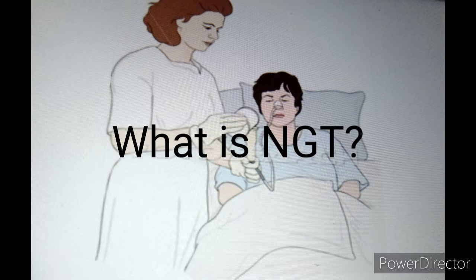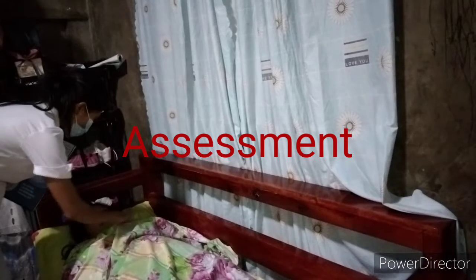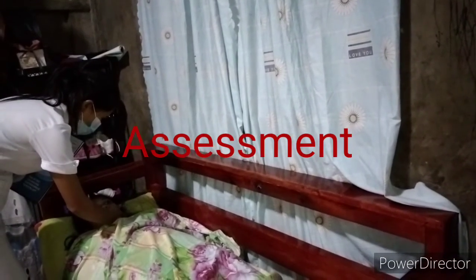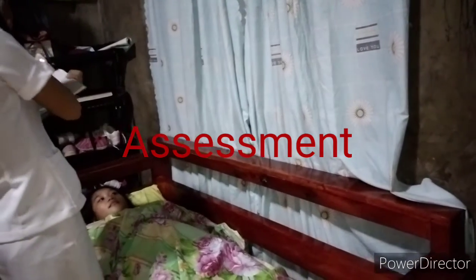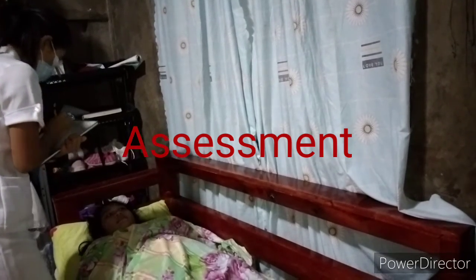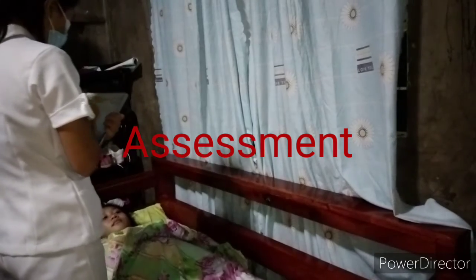So what is NGT? Nasogastric tube feeding is the installation of specially prepared nutrients into the stomach through a nasogastric tube. And for assessment, assess client need for enteral tube feedings: impaired swallowing, decreased level of consciousness, head and neck surgery, facial trauma, surgeries of the upper alimentary tract. Rationale: identify clients who need tube feeding before they become nutritionally depleted.